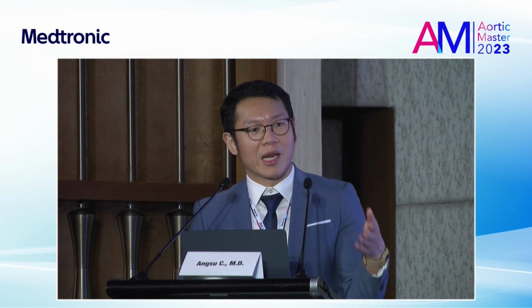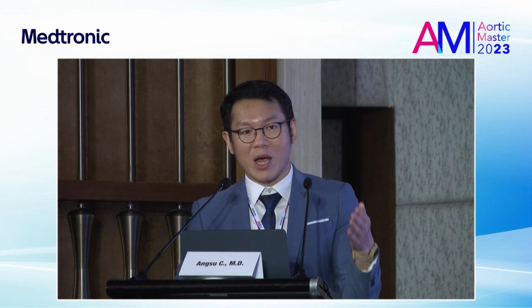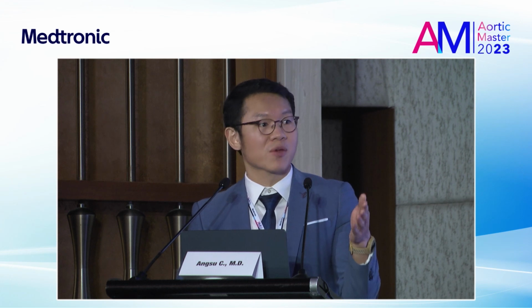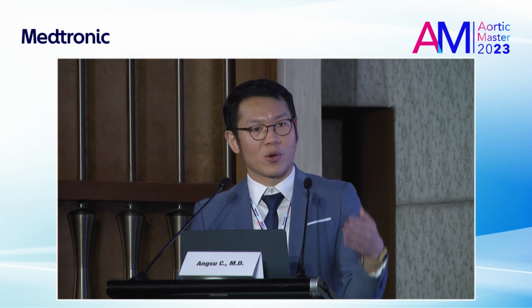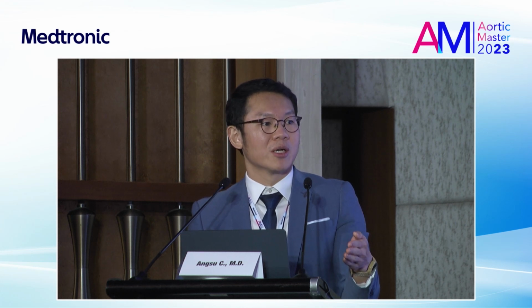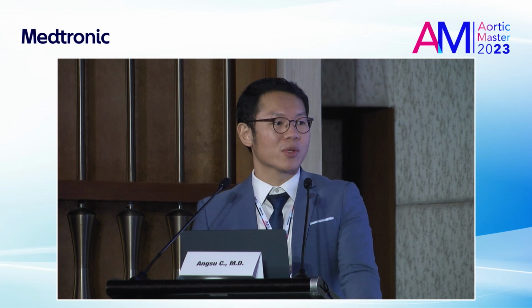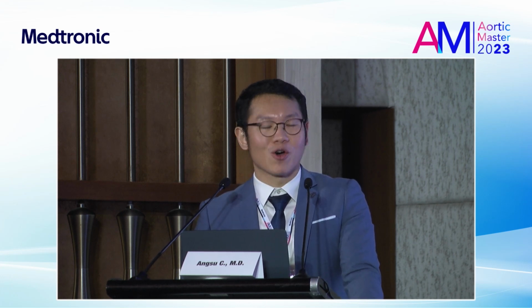You can select the true lumen on both sides, but you have to check with your anesthetist by the transesophageal echo every time when you put the guide wire, when you put the catheter, whether it goes into the true lumen or not. If it goes in the true lumen, any side you can use, left or right. You use cut down, right? Now they normally percutaneous. Percutaneous.